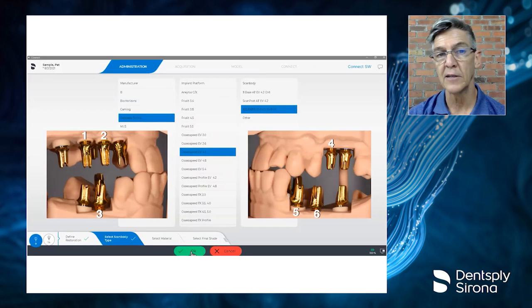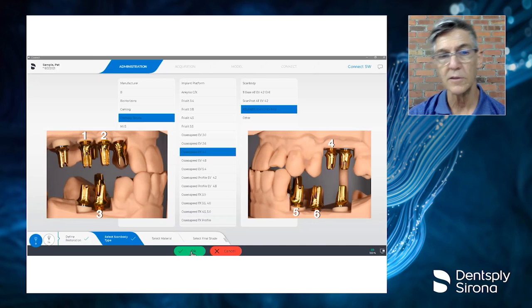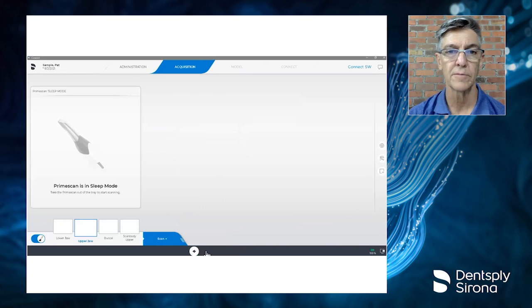And in this case, I've got six implants that are a 4.2. I enter it once for those six implants. Now I've got scan bodies for all six. And all I have to do is enter the dimensions for the other implants that are not the same. So you choose which ones are duplicates, in other words, the same dimension, and you now have scan bodies for all those. And you just edit out what you need to for the others.